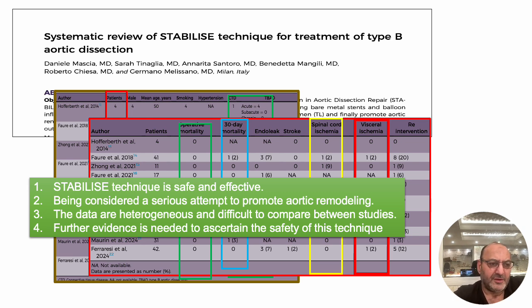So there is merit for it, and we do it. In our institution, we do it routinely. And I can tell you, we're very, very happy with the outcome of these cases, because even a couple of days after, on a CT scan, you see complete resolution of the false lumen. I'll show you two cases. One case where we ballooned with the STABILISE technique and one case where we did not. We just put the dissection stent.